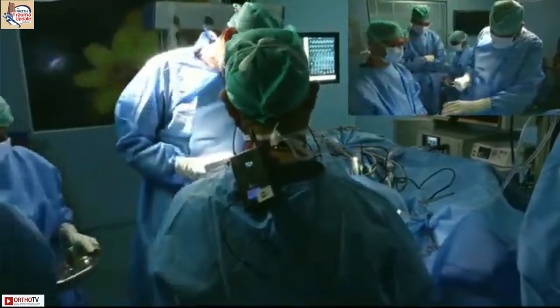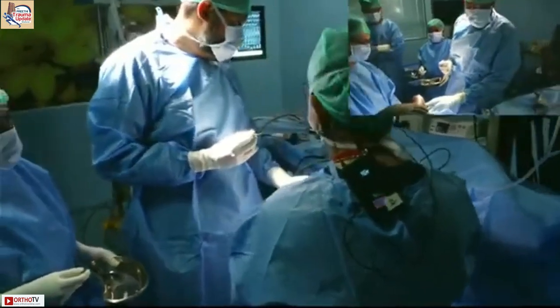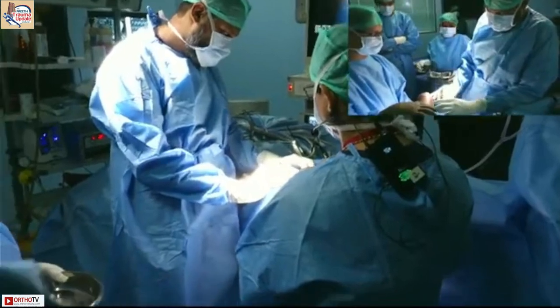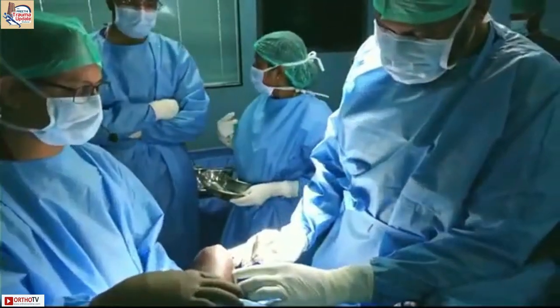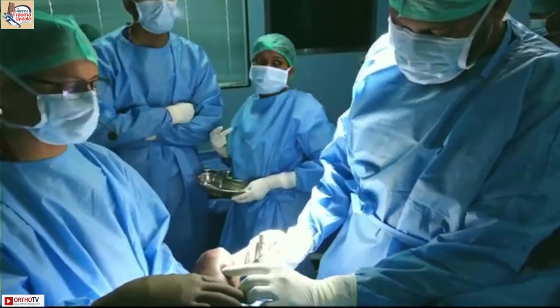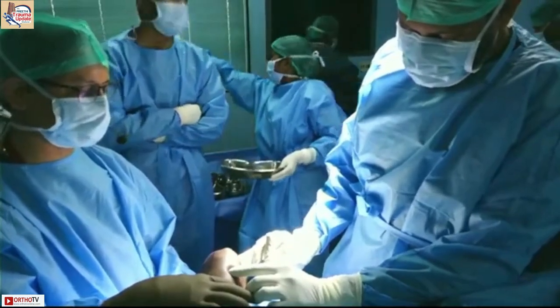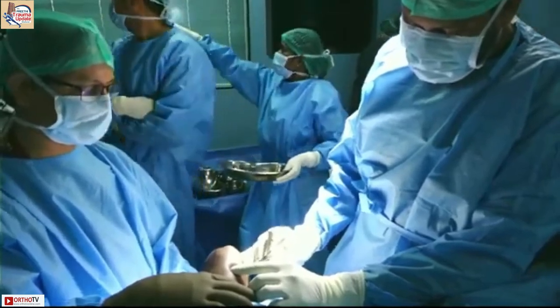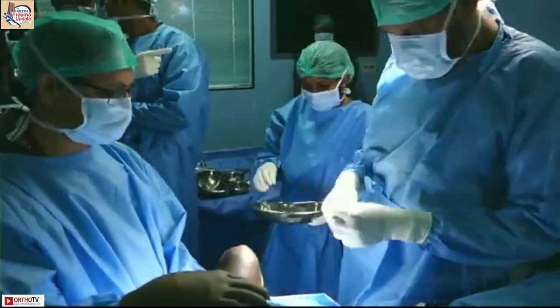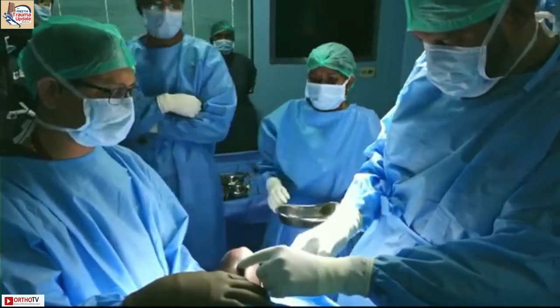So this is the anterior portal here. And we'll just make a small... Can we have a close up view? We cannot see the... Right. So the portal, the marking. So you always start anteromedial after the insufflation of the joint. And then it's a skin cut and dissection.